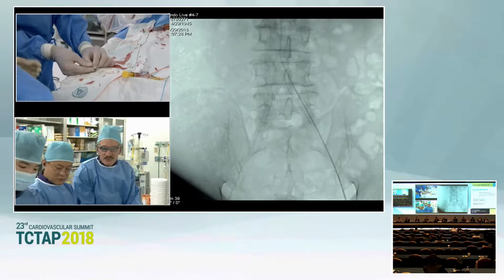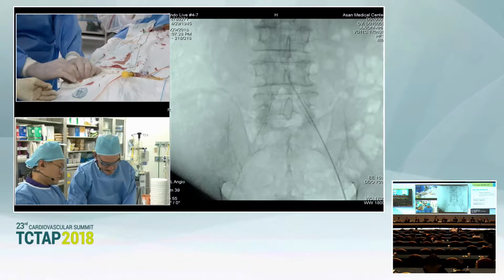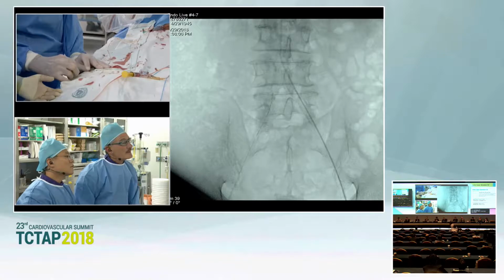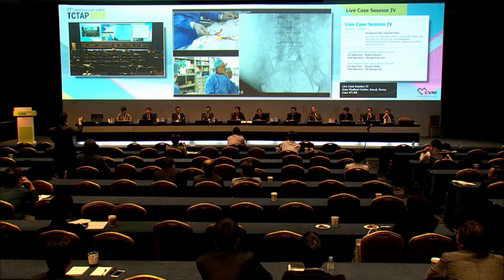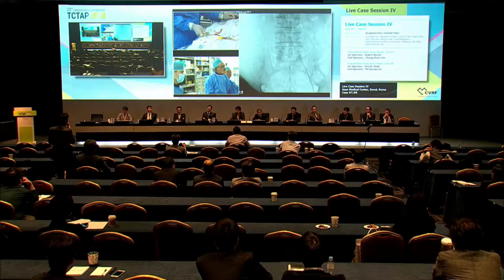So the Torker, please. I'd like to comment on one thing. I'm Dr. Lee from Chungnam National University Hospital. I personally do this kind of CTO region by transradial and ipsilateral femoral approach, not transbrachial, because we have a long, slender shuttle sheath, 110 cm, that reaches to the aortic bifurcation. So transbrachial is not needed. Transradial is a very good option for this kind of region because of the perpendicular angle, and the common iliac artery ostium is very short, but backup support will be poor from the contralateral femoral approach.